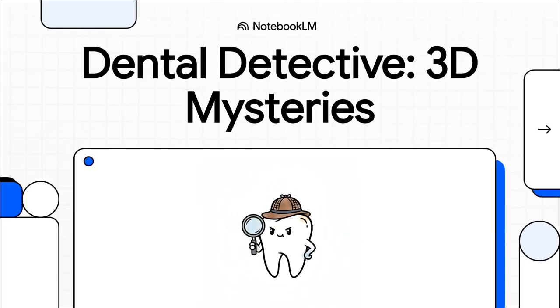All right, have you ever thought of your dentist as a kind of detective? Because today, that's exactly what we're going to do. We're diving into a 3D mystery that dentists have to solve all the time, using just a flat 2D clue, an x-ray. We're going to find out how they pinpoint exactly where something is hidden inside your jaw.